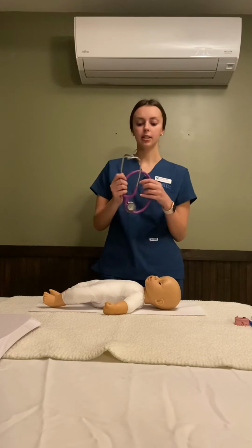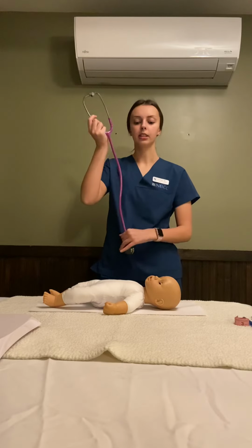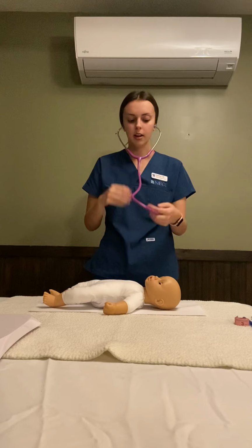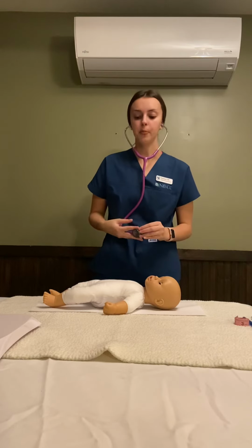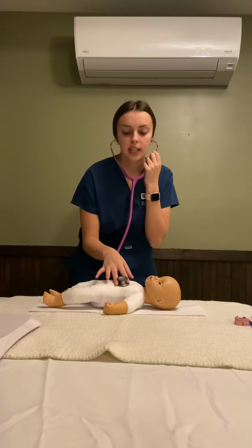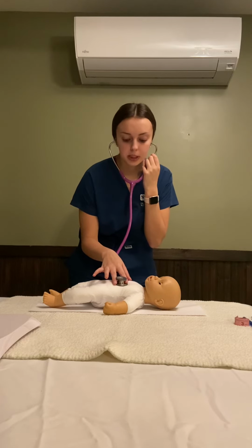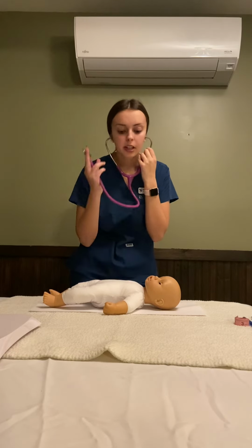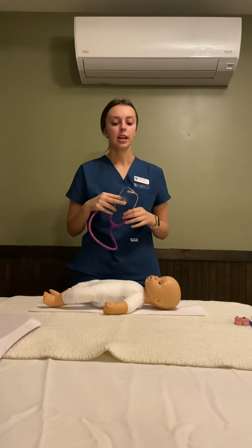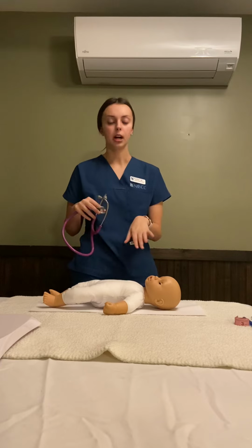So I'm going to take my stethoscope, and this is located at the fourth intercostal on the left sternal border. And I'm going to listen for a full minute. And it typically should be between 110 and 160 beats per minute, and it may be irregular. And you should do this when the baby's at rest.